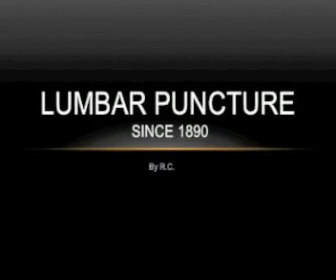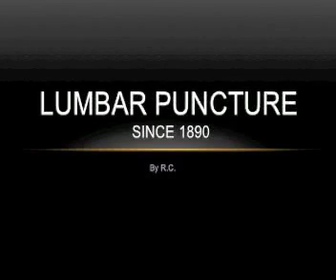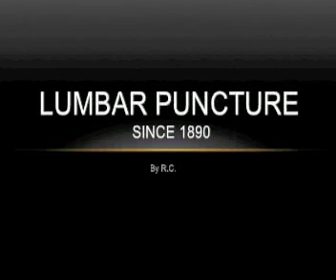Hello, I will be talking to you today about how to do a lumbar puncture, or LP for short. The indications, contraindications, tools and equipment, steps of procedure, and complications will all be discussed, followed by an actual demonstration of how to do this procedure.